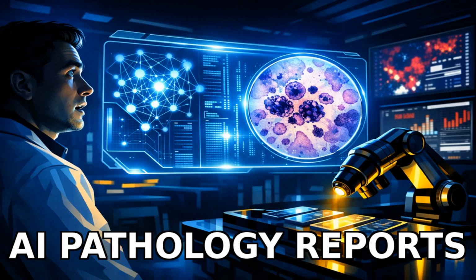What if a machine could roam a pathology slide like a detective, labeling clues and drafting a diagnosis all on its own? Imagine agentic AI that navigates tissue images and writes the report with almost no human prompting.